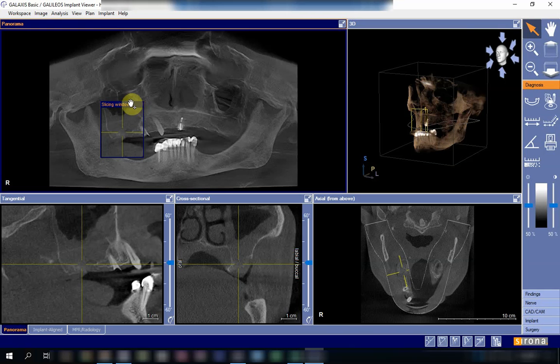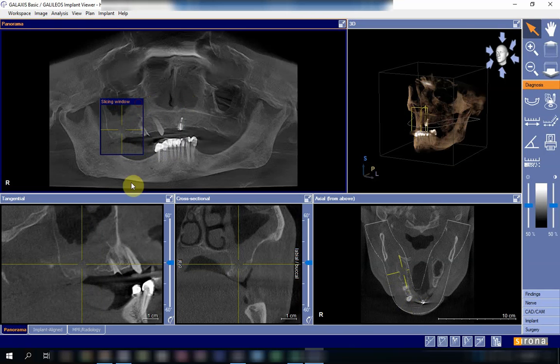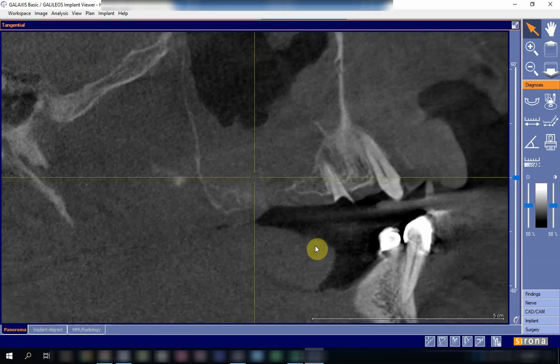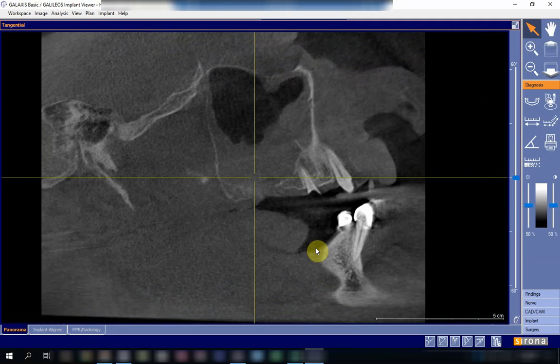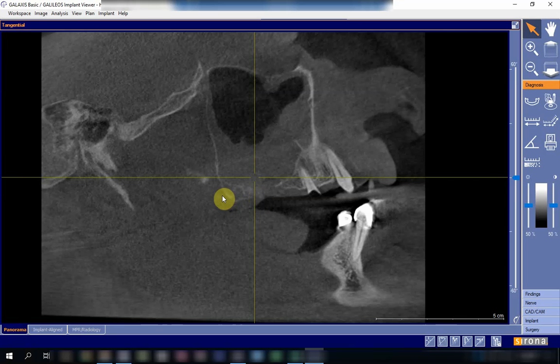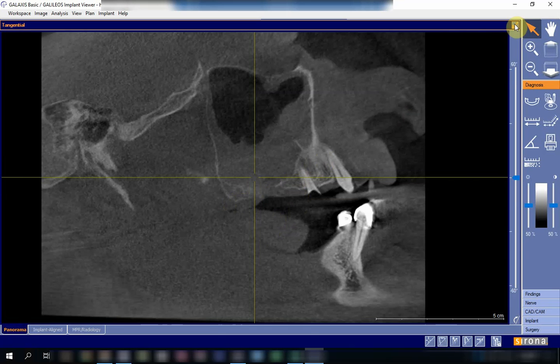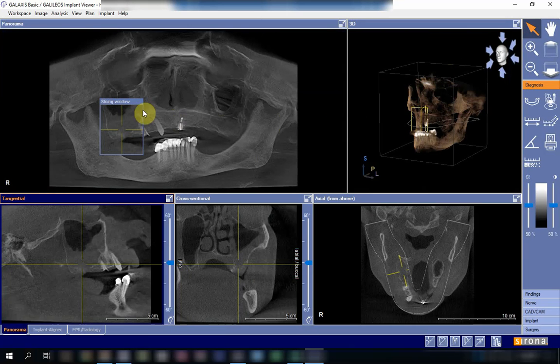Looking at this patient, the alveolar bone appears to have been resorbed. It seems that the teeth were extracted a long time ago, which is evidenced by the resorption of the alveolar process. This resorption leads to approximation of the floor of the maxillary sinus to the alveolar bone and hence to the oral cavity, which increases the risk of oral antral communication.